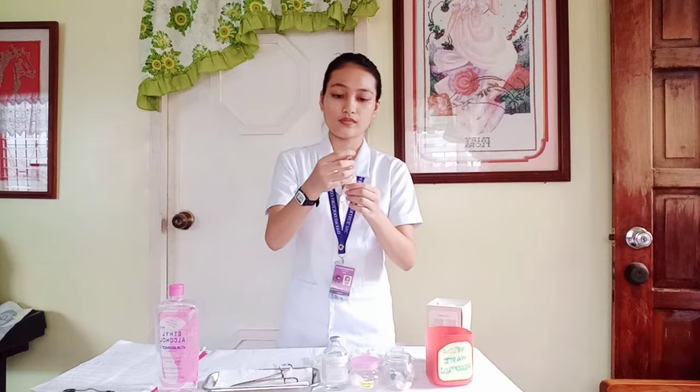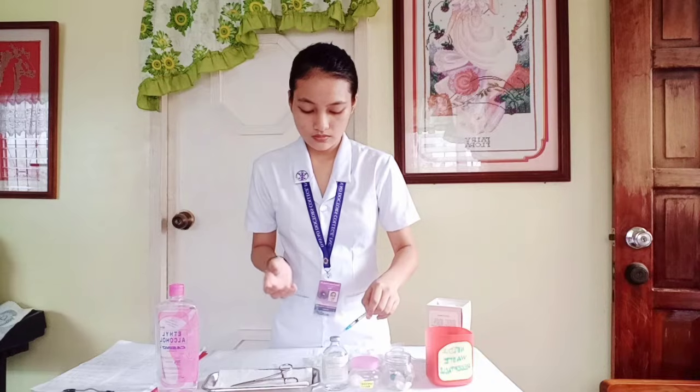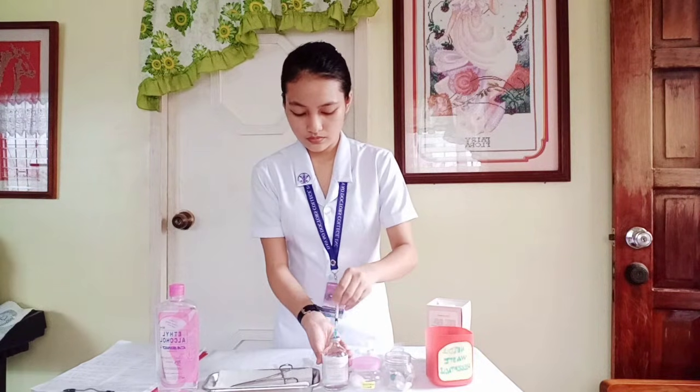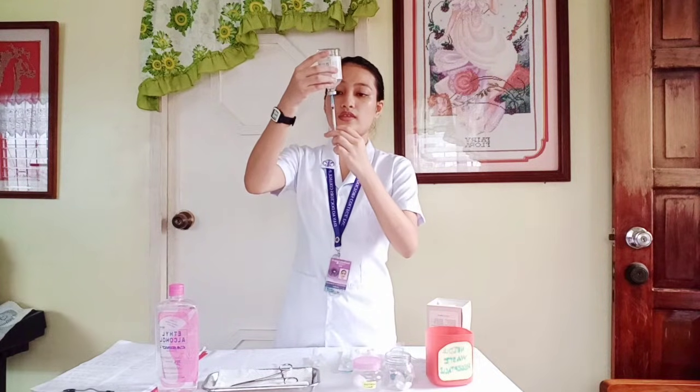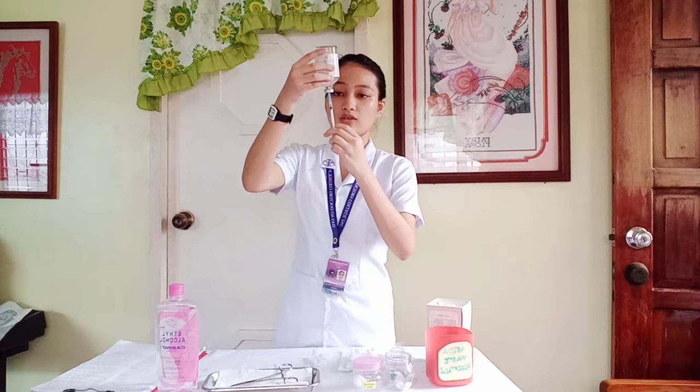Now take the syringe, uncap the syringe, and then draw some air inside the syringe. The volume of air that is needed to be drawn inside this syringe is equal to the amount of medication as ordered by the doctor. After that, inject the air into the vial. Invert the vial and draw the exact amount of medication needed.